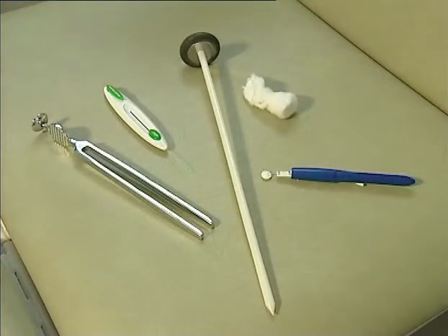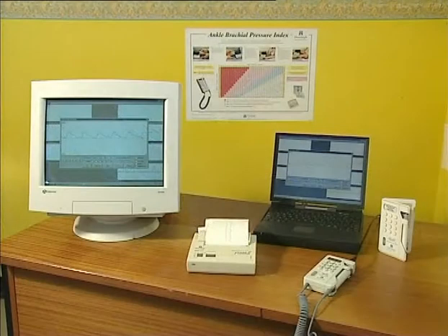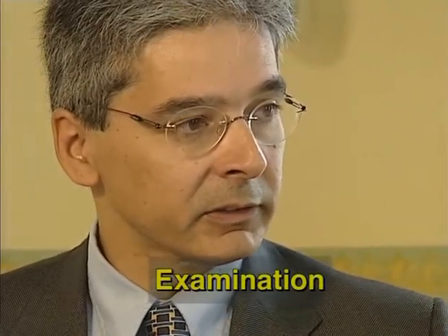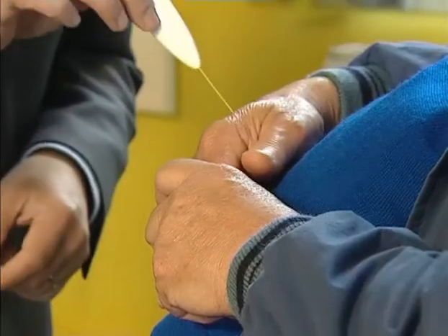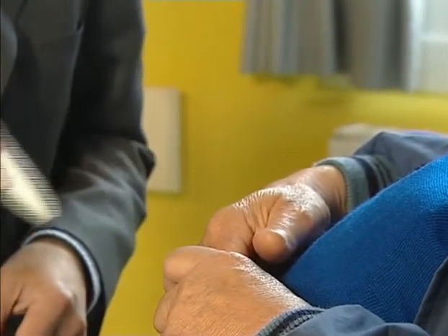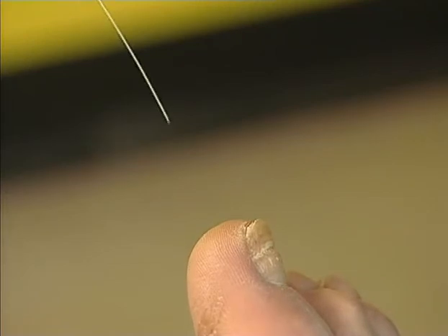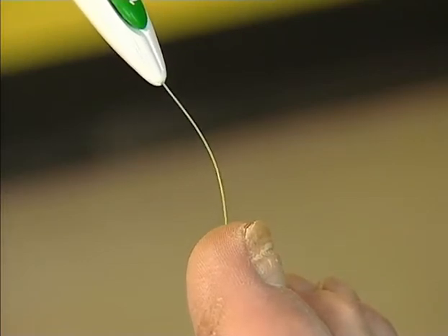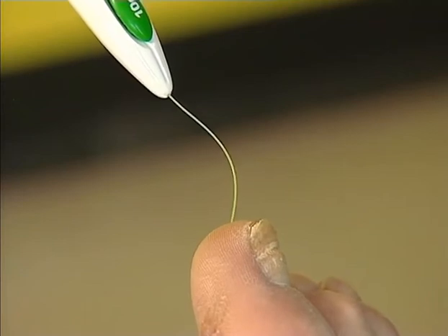We are going to demonstrate a few of the tools that are most commonly used. And finally, back on the hand. We should explain to the patient what we're going to do. Can you feel that? Begin by testing on a sensitive skin surface. Now carry out these tests on the patient's foot at various sites, avoiding any calloused skin areas. We ask the patient to close their eyes and say yes every time they feel something.